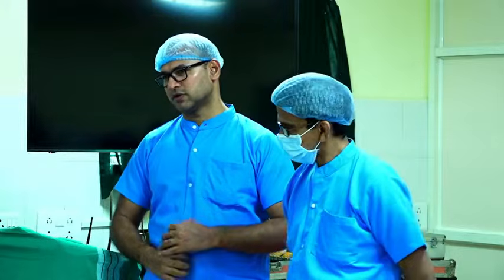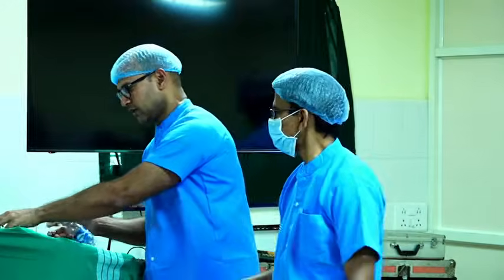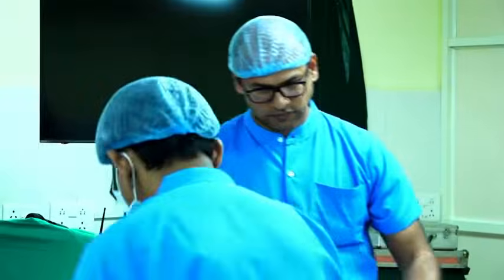Damage is less, and precisely you can cut the normal tissue and do a plasty. Carbon dioxide takes so much time to do. It cuts very slowly. The fiber also cuts slowly, not very precise, but damage is less. Even for subglottic stenosis, you can use a free beam if it's above about 3 centimeters. You use the laryngoscope to retract the vocal cord and then do it. So we have done one.